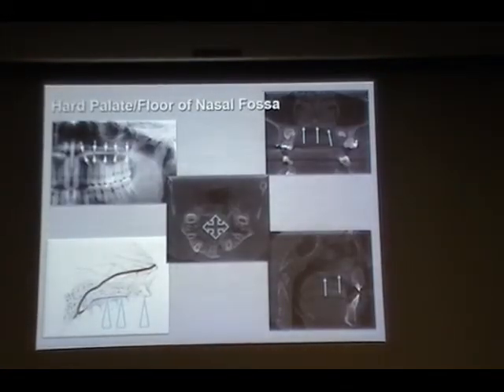So moving on. Here is an example of hard palate that you are seeing. And this is a coronal image where you can see the hard palate intact.